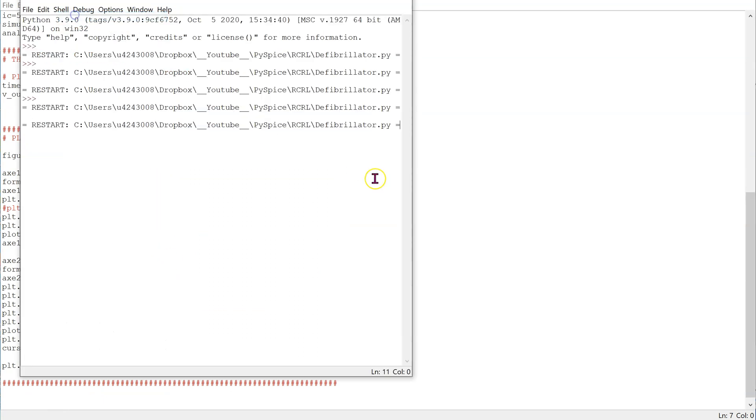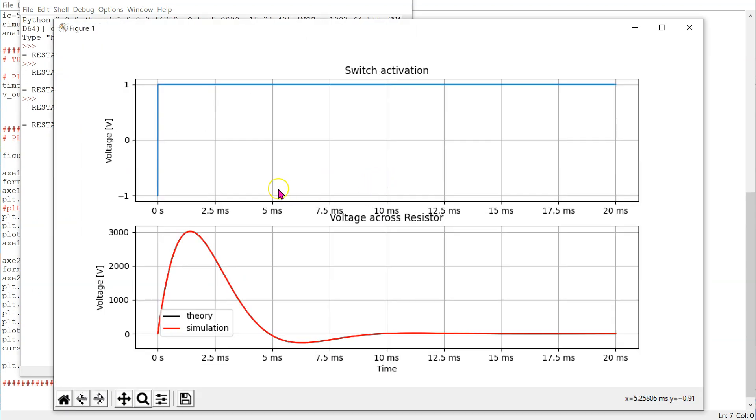When we run this code we can see both the switch activation as well as the output voltage results. We can see that the simulation and theory curves actually overlap and match perfectly, and we have the same output waveform as before.